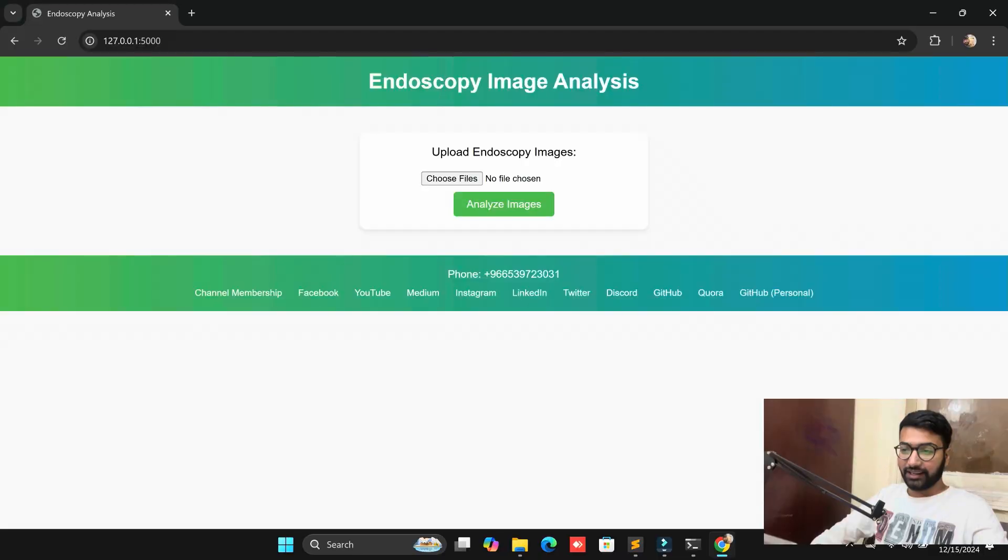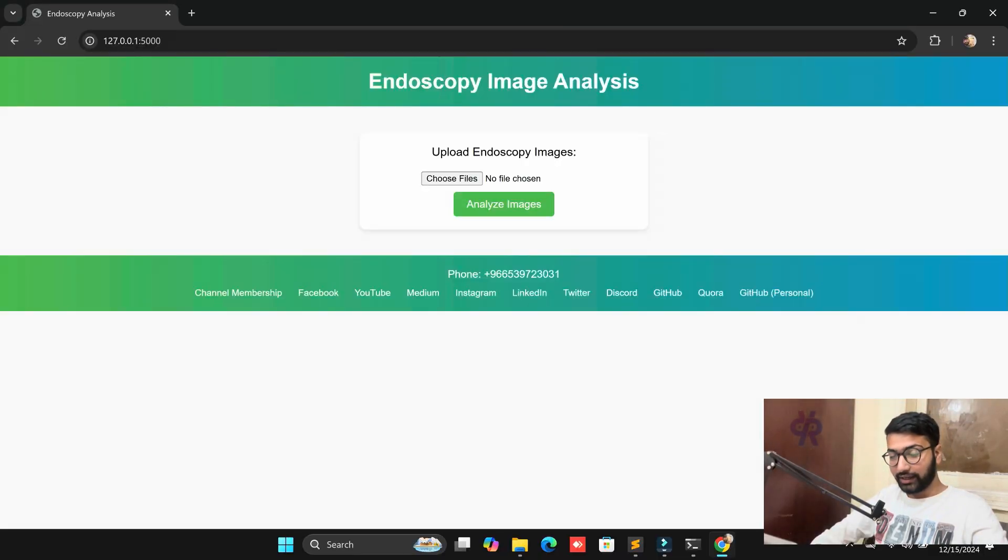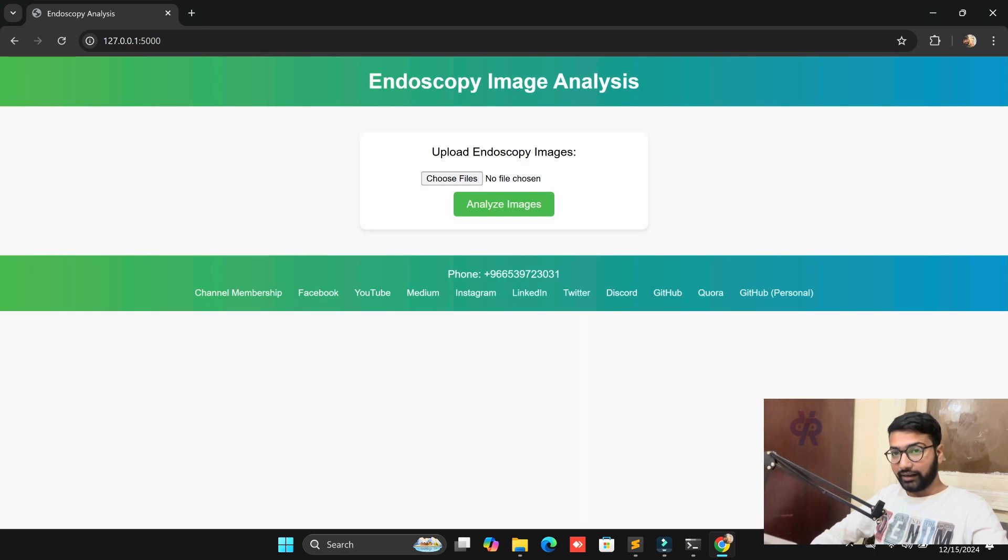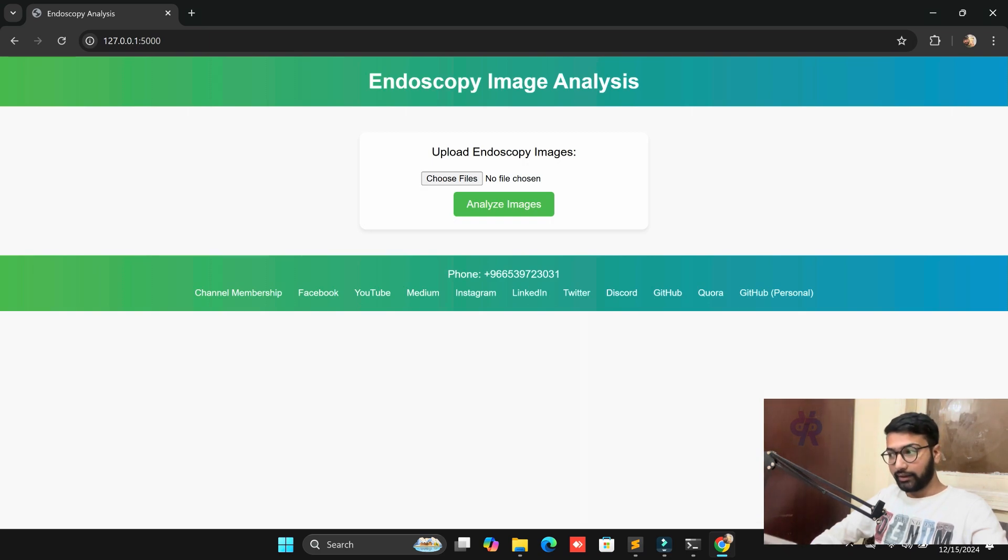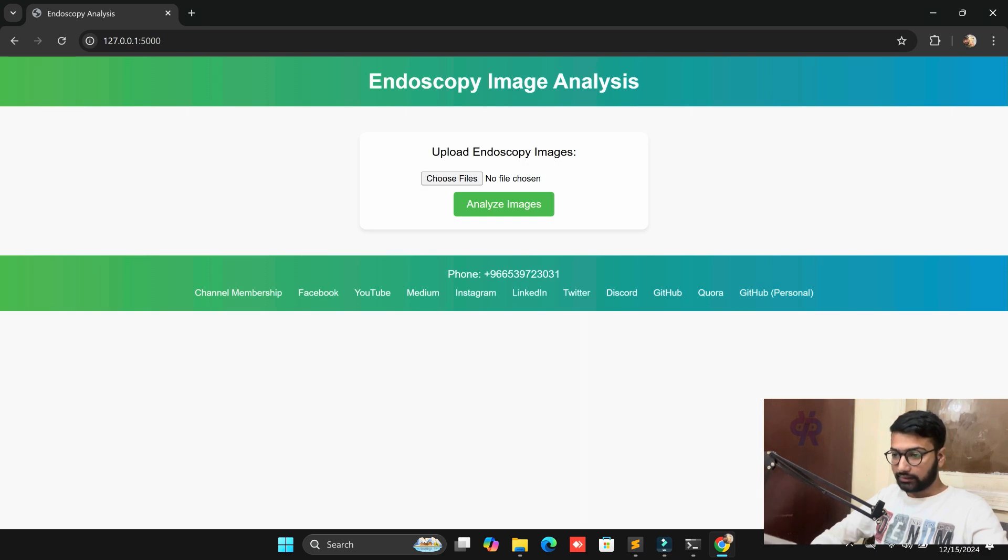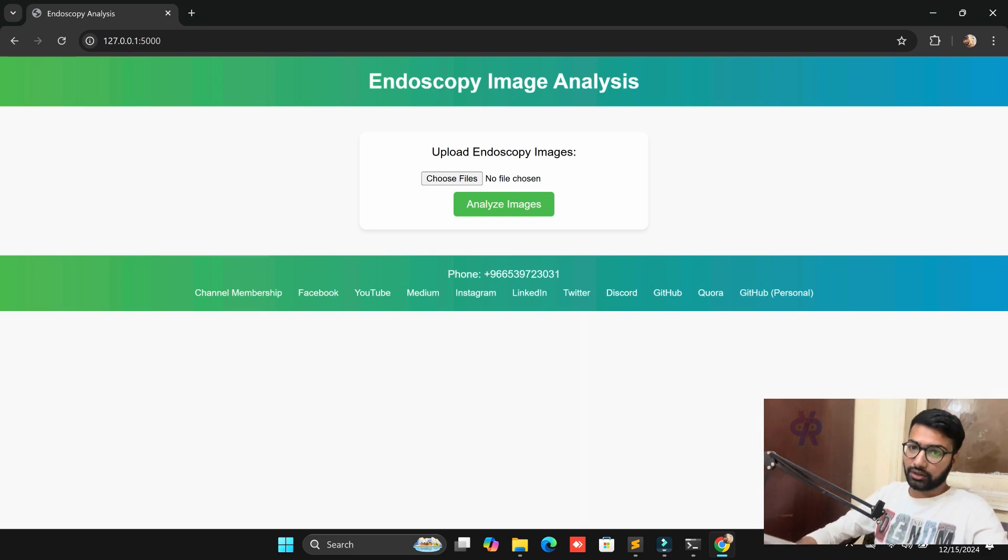Hello viewers, welcome back to Pailisa channel. In this video we are going to explore endoscopy image analysis. This is a very important topic for me and how we integrate AI and read the imaging analysis with the help of custom datasets. Let me explain one by one and start from scratch.